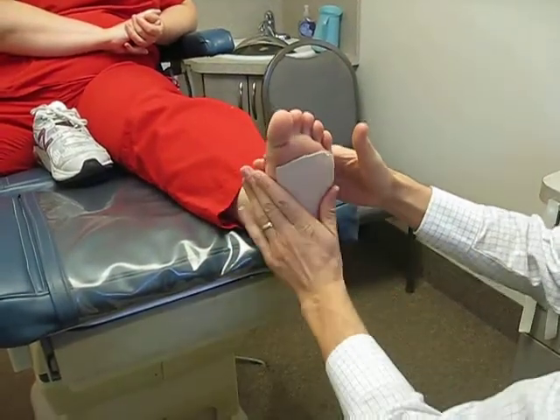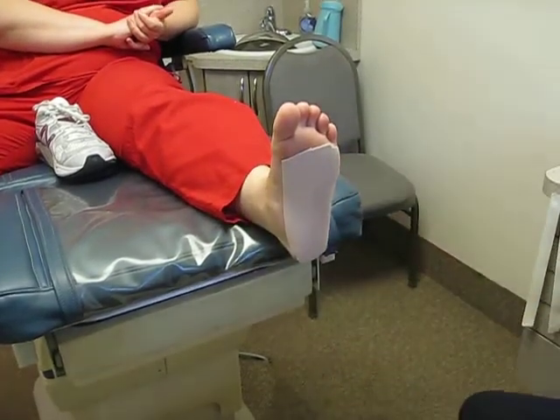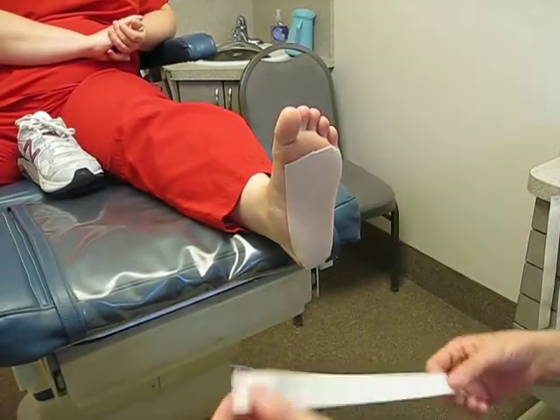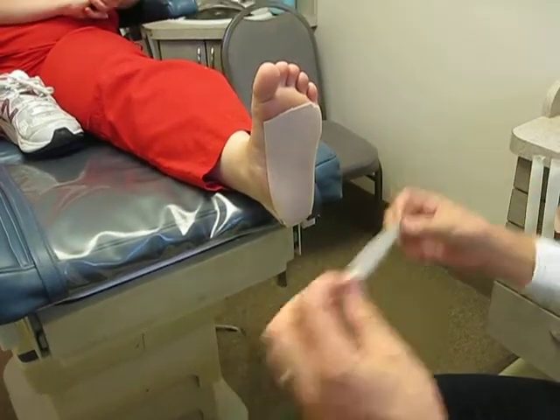Taping is a very particular thing for each patient, and everyone likes it differently, so you kind of have to experiment. The next layer is 1 inch athletic tape. This is very stable tape — it's not stretchy at all, which is very important.